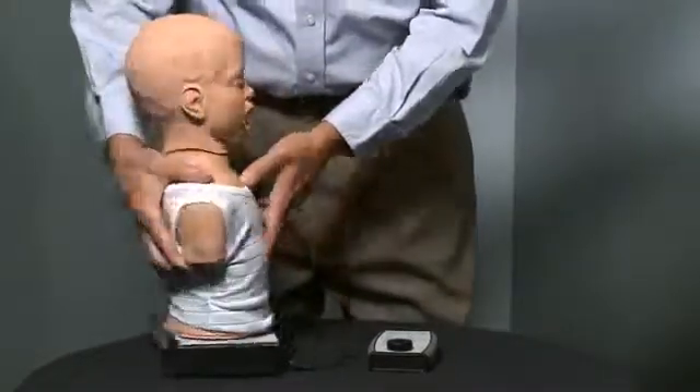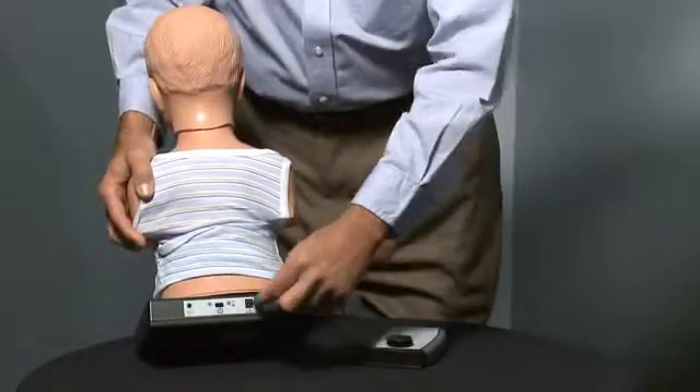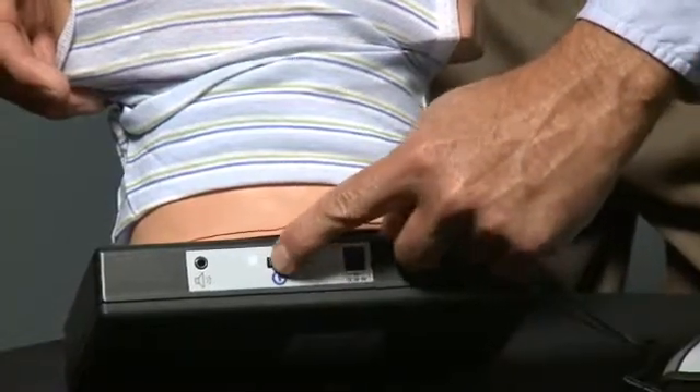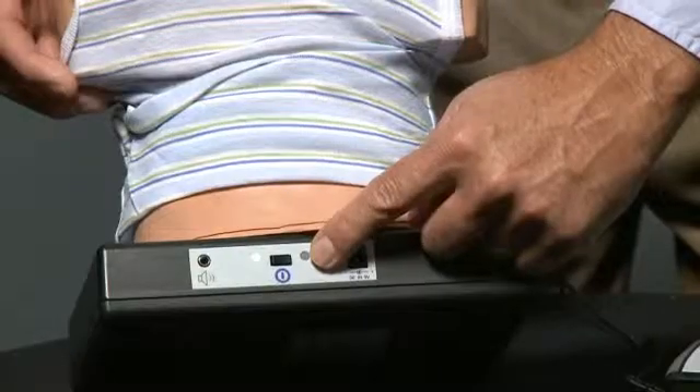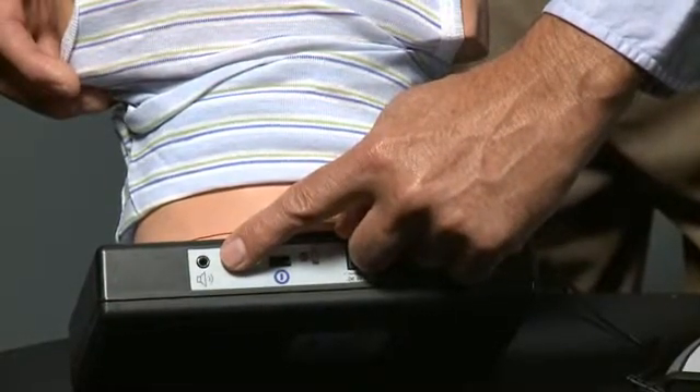Let me start by showing you where to hook up the battery and power supply for these units. The child itself is operable from battery, but you can also plug in a 110 power supply to the back. Once on and the batteries are charged, hit the power button to turn it on and the green light comes on. There is also a speaker jack on the back so that you can broadcast sounds to the class.